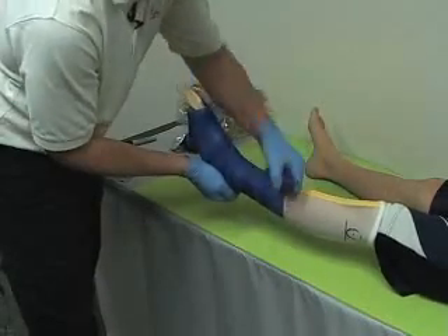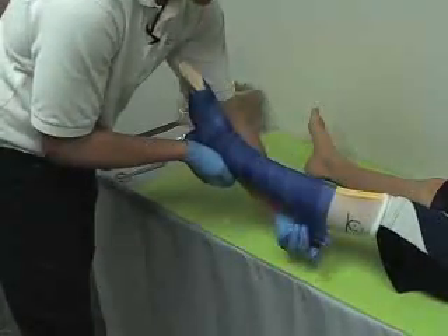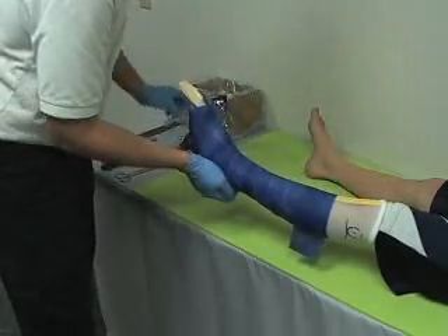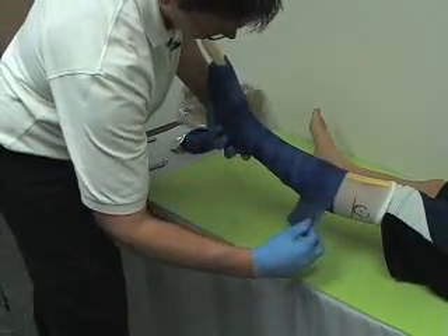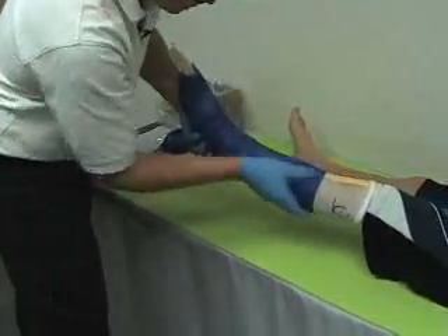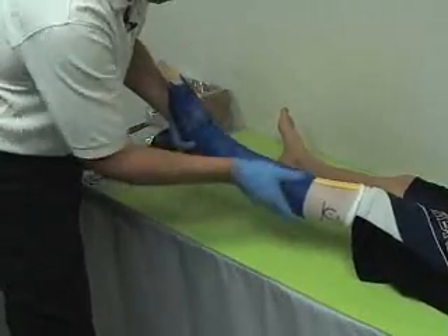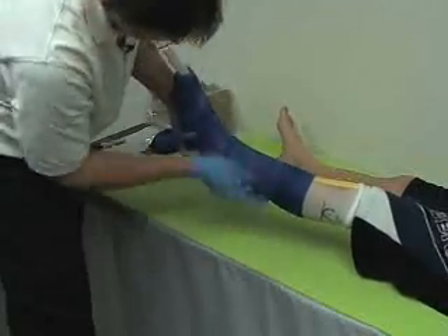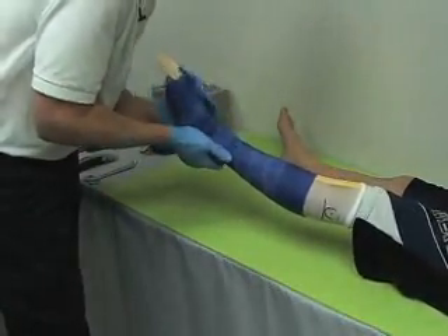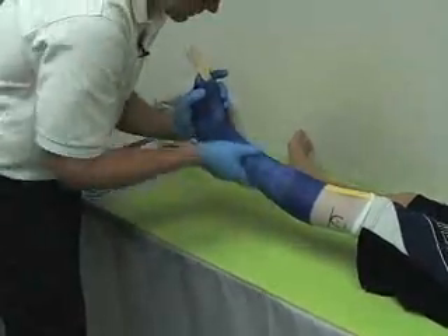Do not want to stretch the fiberglass too much — lay it on nice and easy. In the case of our patient here, he is going to be receiving a mid-profile orthosis, so I do not need to go all the way up. It is very important with fiberglass: if you get any wrinkles from roping, you need to really rub them in well. The rubbing gets rid of the rope and also prevents the cast from coming apart.